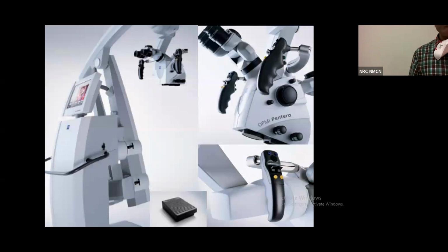Now, this is a typical operating microscope, and these microscopes are multi-purpose. They can be used by ENT surgeons, ophthalmologists, urologists, and endocrine surgeons. The basic concepts of any microscope are primarily the same. If you see here, this is the very bulky body that it has, and this is the arm, and this is the optical part of the microscope. This optical part is enlarged here. This is the surgeon eyepiece through which the main operating surgeon would be looking, and this is the observer eyepiece through which the assistant shall be looking.